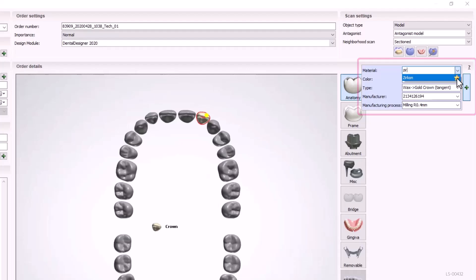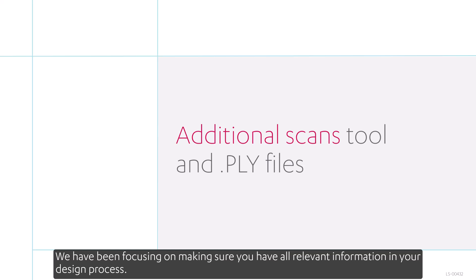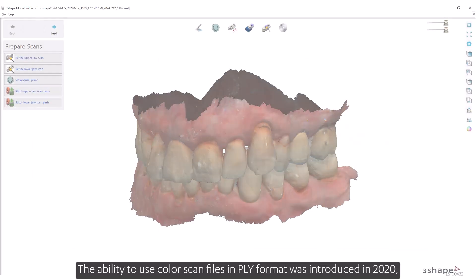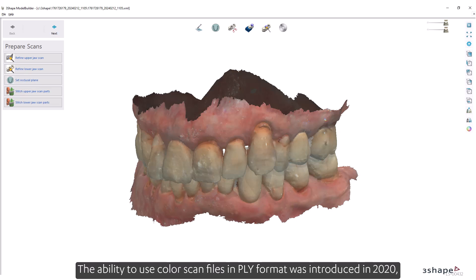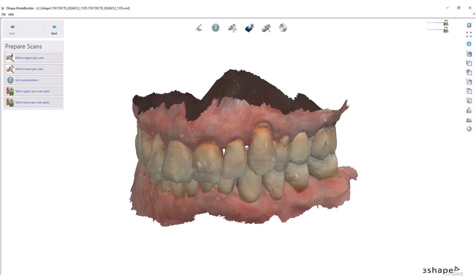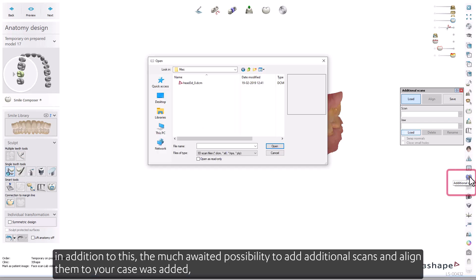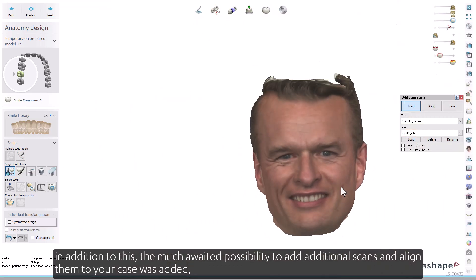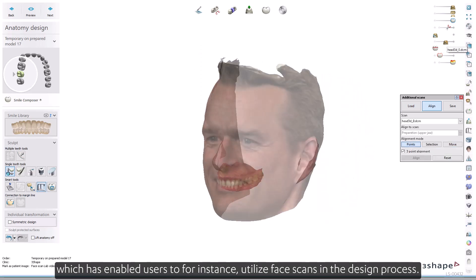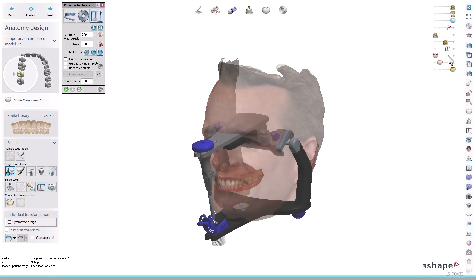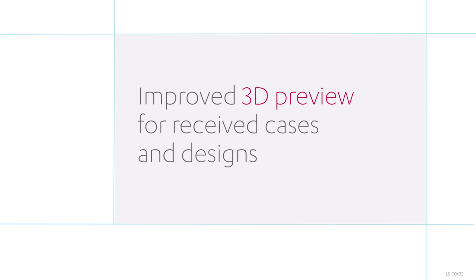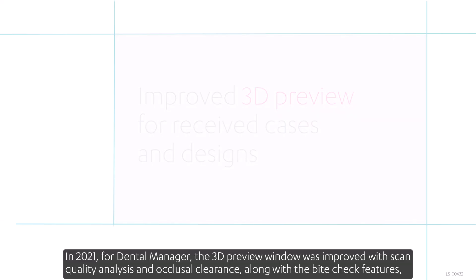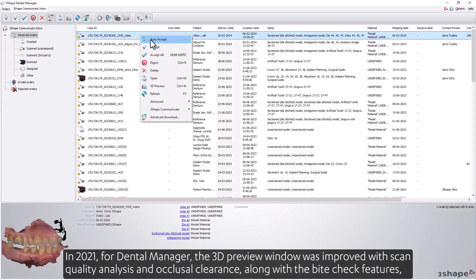We've been focusing on making sure you have all relevant information in your design process. The ability to use color scan files in PLY format was introduced in 2020. In addition, the much-awaited possibility to add additional scans and align them to your case was added, enabling users to utilize face scans in the design process — but more on this later.